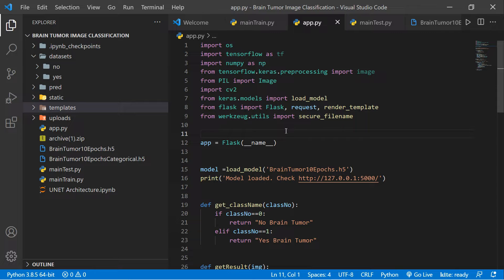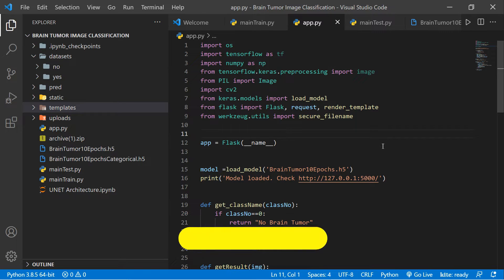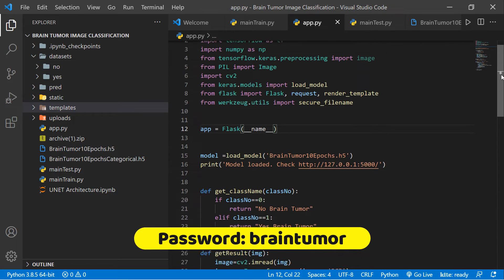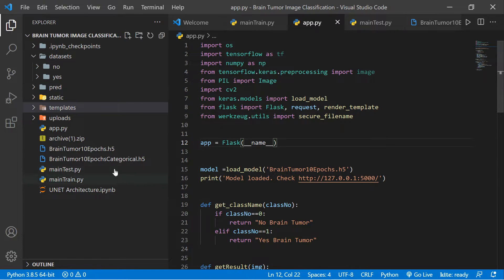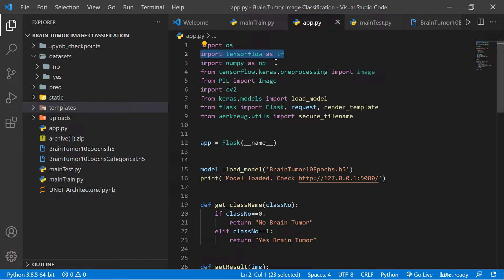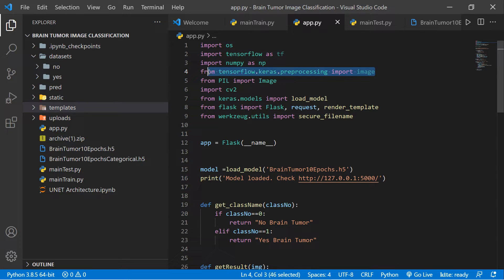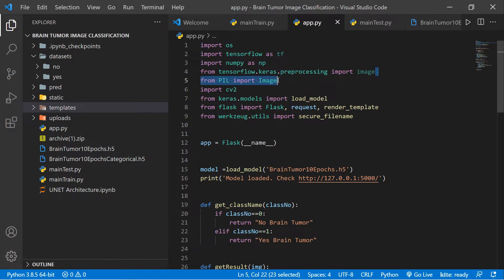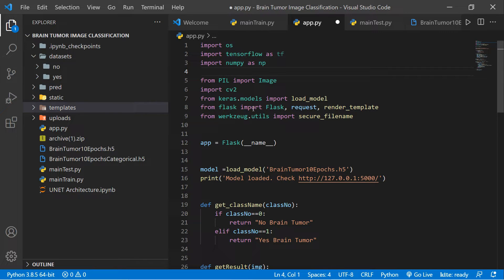The GitHub password is 'braintumor' in lowercase. Now let's discuss the code. First, we need to load the model, and we need to import the libraries. You can see we import OS, import TensorFlow as tf, import NumPy as np for multi-dimensional calculations, and from tensorflow.keras we import the image preprocessing utilities. From PIL we import Image, and import cv2. From keras.models we import load_model. And from Flask we import Flask, request, and render_template.